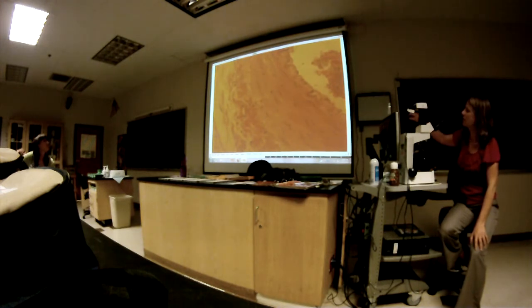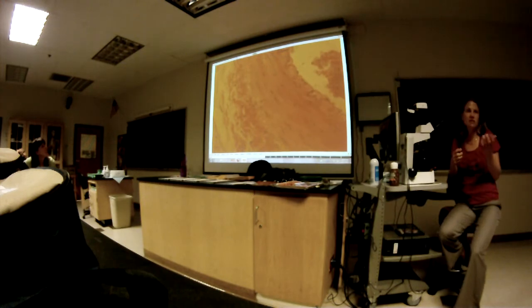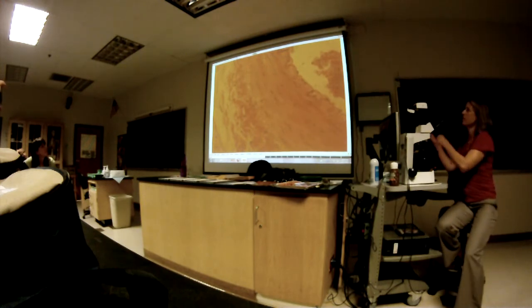So this is the tunica media. See that? It's all the way from there. There's the border of it, and then this is the border of it here. So the intima layer, here's the endothelium, here's a nucleus. It's just simple squamous. So it's very thin, very, very thin.